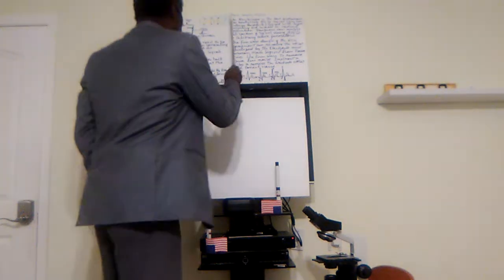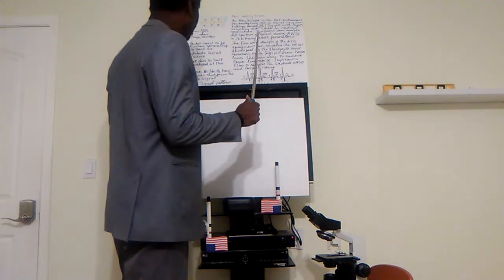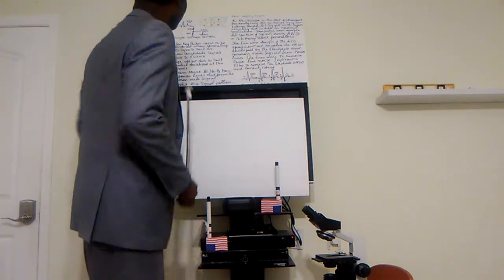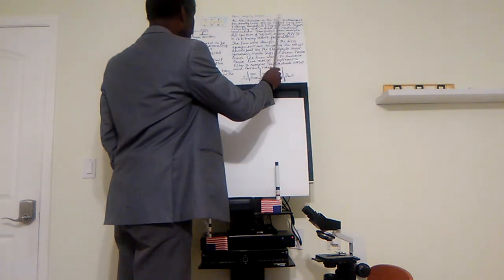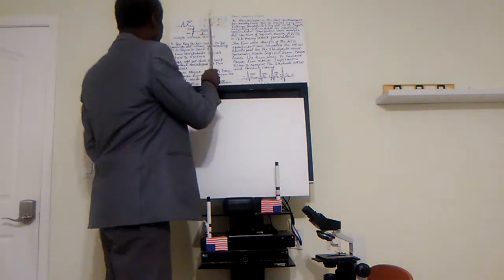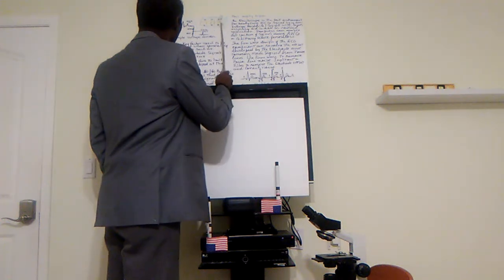Now we see an oscilloscope, and I must apologize for the view. We should have had a more amplified, larger view, but this is what we can facilitate at this time. An oscilloscope is the best instrument for analyzing the ECG signal, a very low voltage amplitude signal, with super accuracy. And here I have a diagram of a basic, normal oscilloscope and the ECG waveform produced by it.